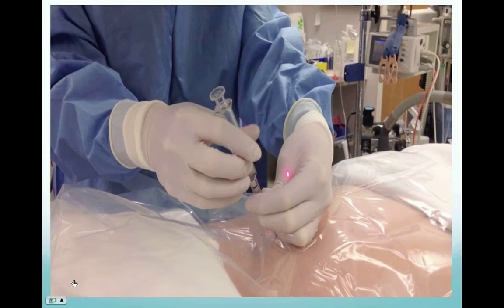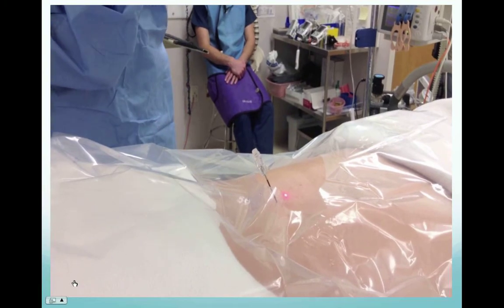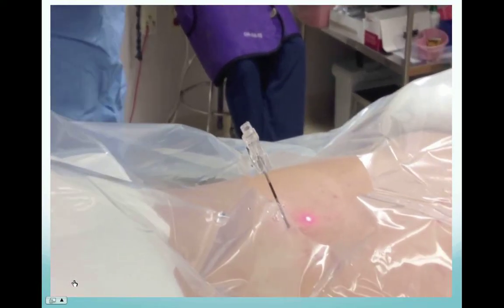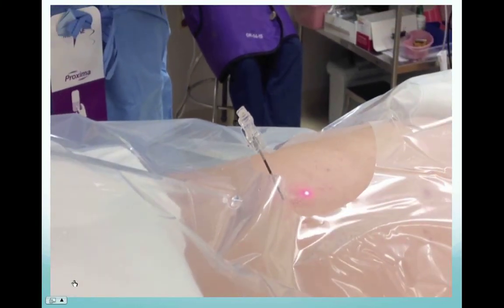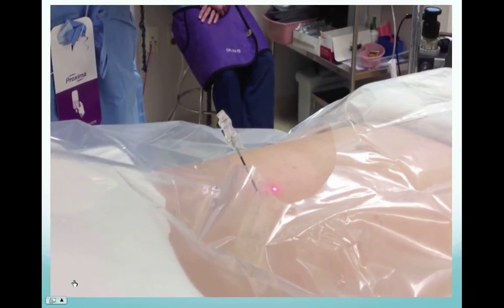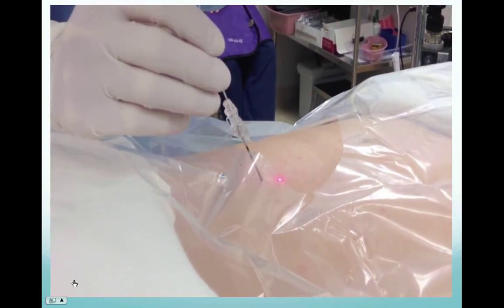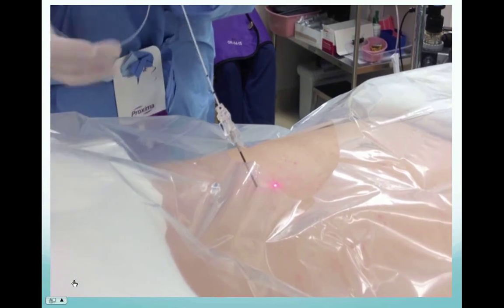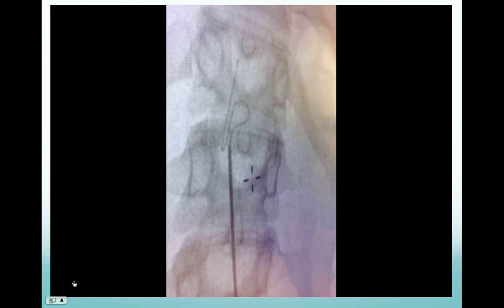Once the epidural space is found, he detaches the syringe and retrieves the epidural catheter. The catheter is a flexible plastic tube that will eventually stay in the patient. It provides numbing medication directly into the epidural space, numbing the nerve roots in the target area, which ultimately provides pain relief for the patient. The catheter is inserted and an x-ray image is taken to see exactly where that catheter is. The goal is for the catheter to be centered and straight for equal distribution of medication.